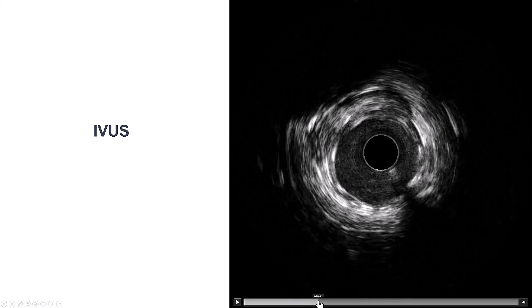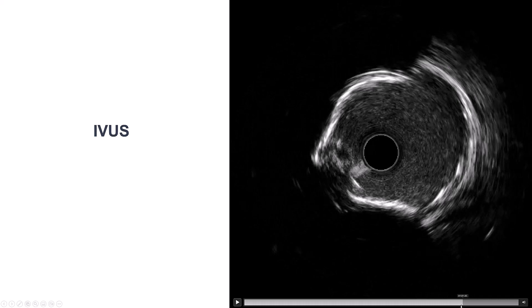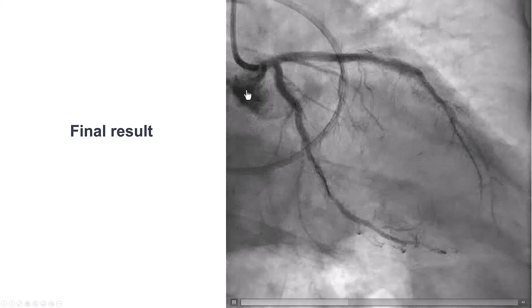Once again, we did intravascular ultrasound. We see that there is good stent expansion all the way into the LAD. Coming back — the diagonal, the left main. Here is the left main bifurcation, and that provided a nice result all the way to the left main. This was the final result — good flow in both diagonal, LAD, as well as circumflex.